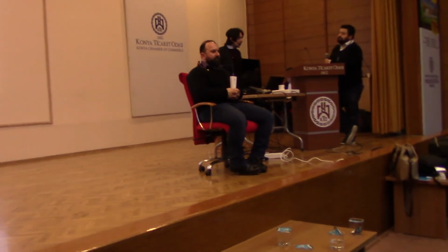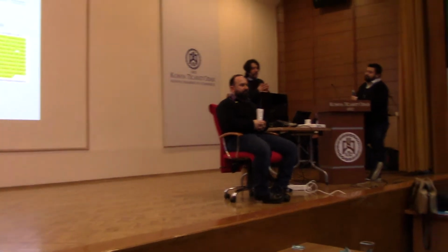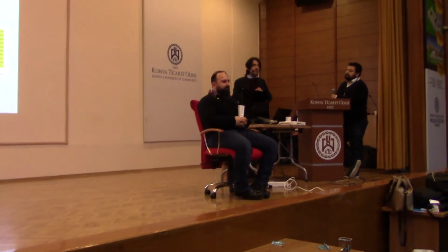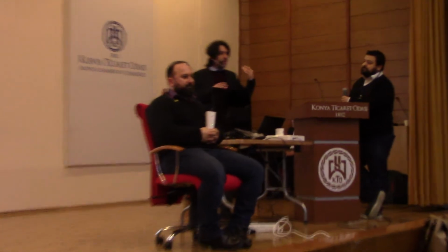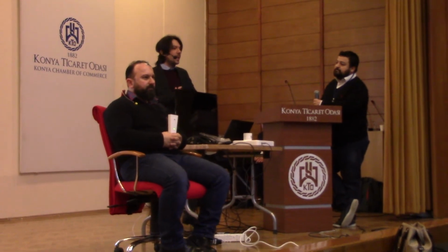Origin in the muscles, and for this reason they are big signals. So we are around even 300, 400 microvolts. We were in the order of nanovolts. So it's another scale of signal.